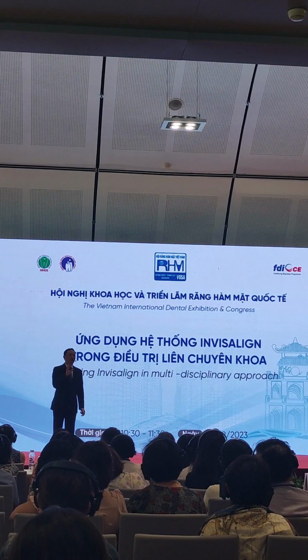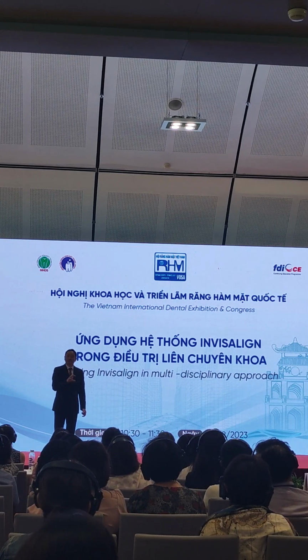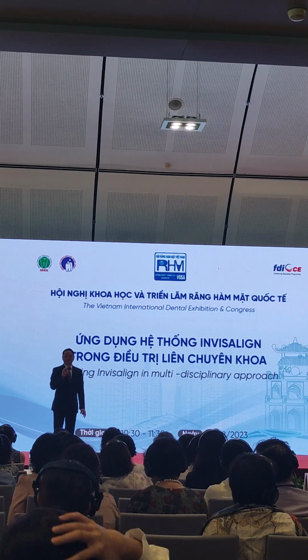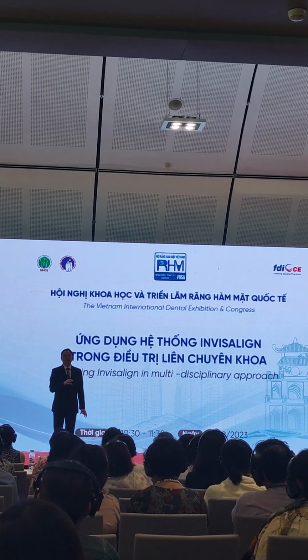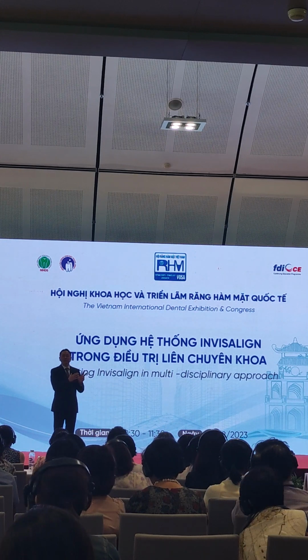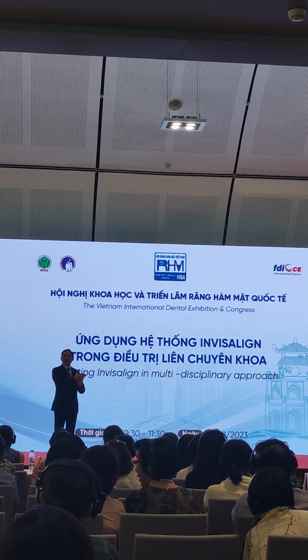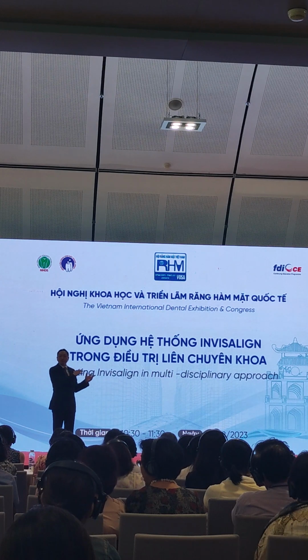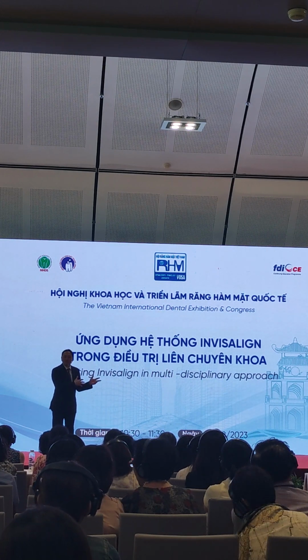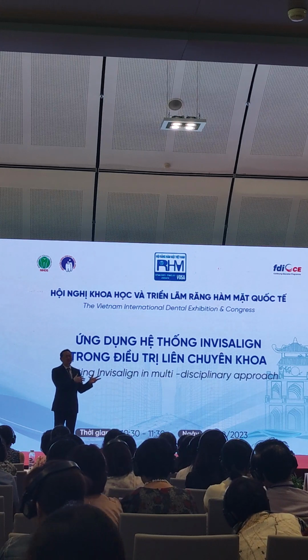So that's why I keep on stressing the importance of attachment design, aligner fitting and retention. If you take these 3 things, aligner fitting with retention, staging, and elastics, most of the time, no matter whether you look at my extraction treatment or other treatments, it is enough.